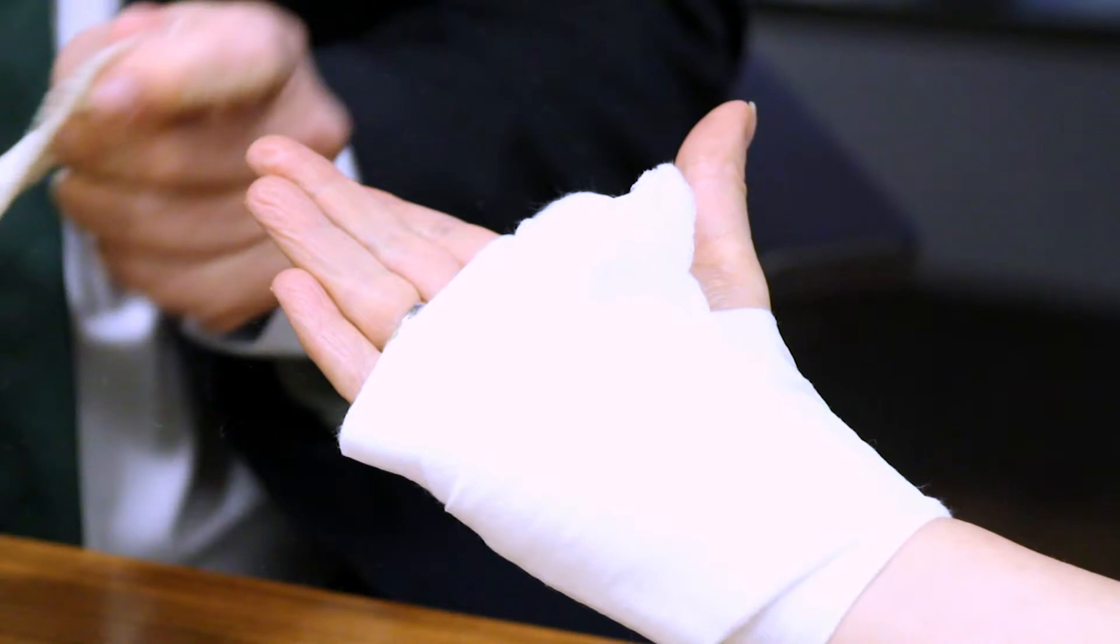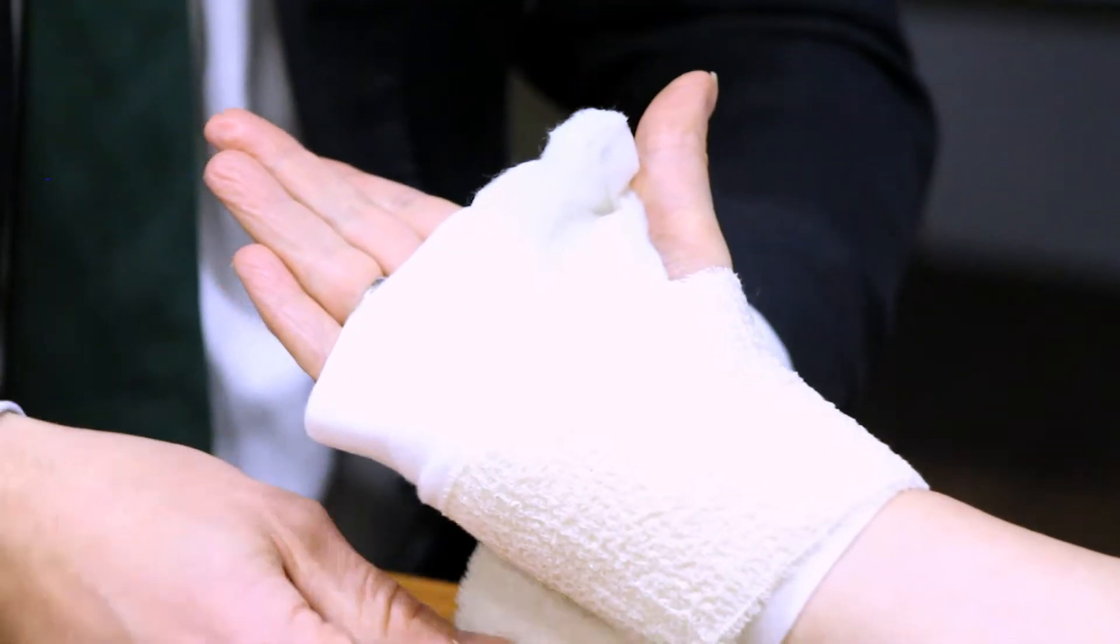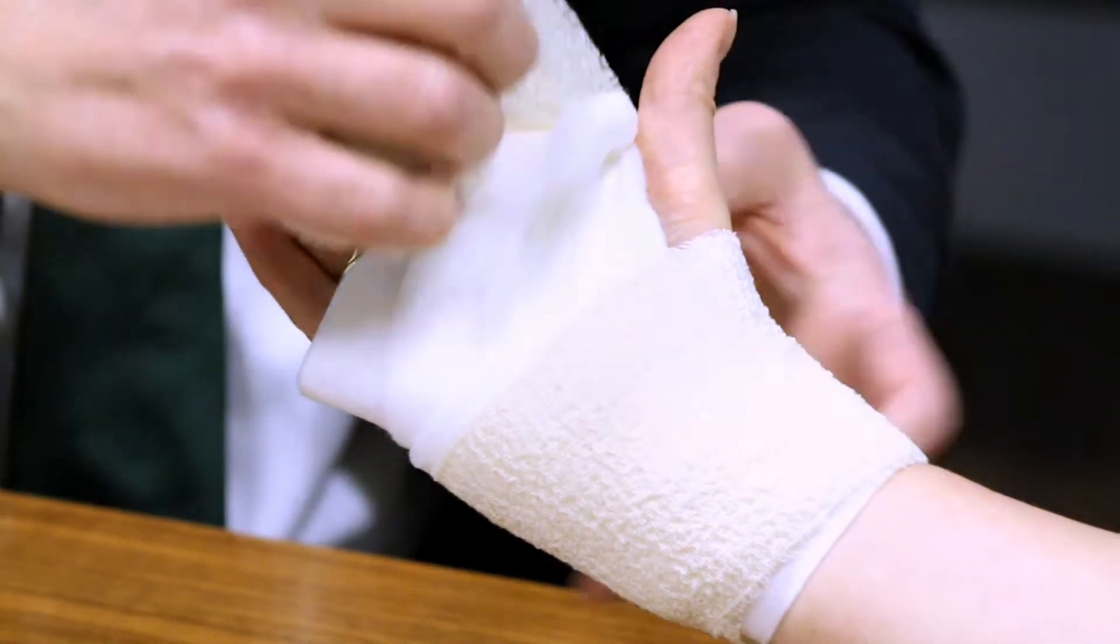And then we'll put a crepe bandage over the top to give it a bit of compression, like this. And through the web space like this, like that.